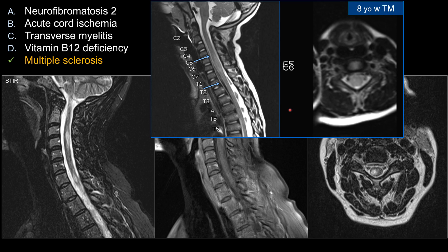For transverse myelitis, this entity tends to be much longer segmented compared to MS lesions — greater than three vertebral body lengths. On the cross-sectional image, rather than involving just the periphery, transverse myelitis tends to involve the entire cord, or at least the gray matter and some of the white matter. The entire cord is involved, and they also tend to be more expansile compared to an MS lesion. So transverse myelitis would not be a better choice than MS in this case.